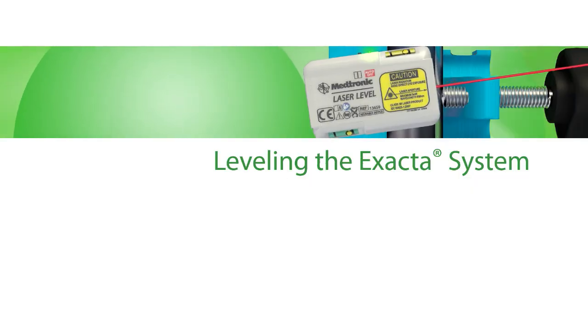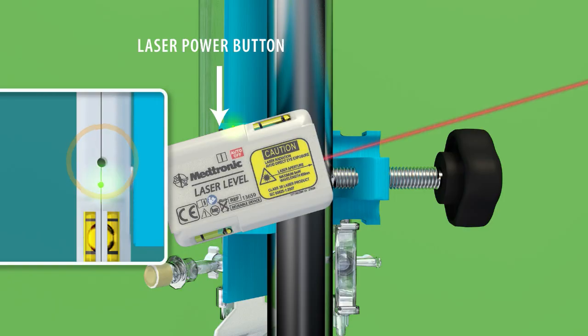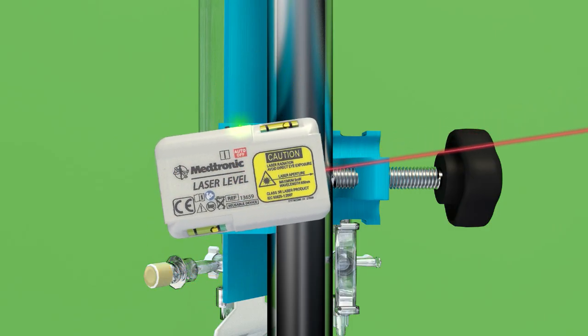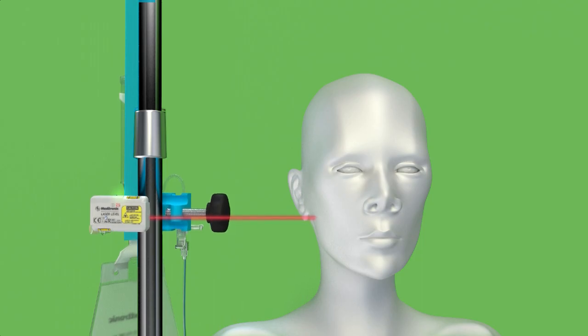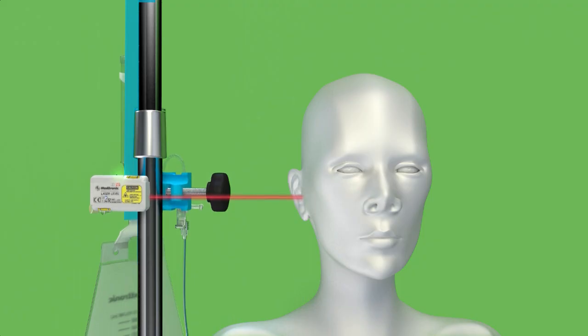Leveling the Exacta System. If using the laser leveling device, press and release the power button, using care not to point the laser beam into the patient's eyes. The beam will appear for 30 seconds once activated. Using the bubble levels located on either side of the laser level device, adjust the alignment until the bubble rests in between the parallel lines. Once the laser is level, loosen the black knob on the pole clamp to raise or lower the Exacta drainage system to a height such that the laser points to the correct landmark on the patient's head or lumbar catheter exit site for lumbar drainage.